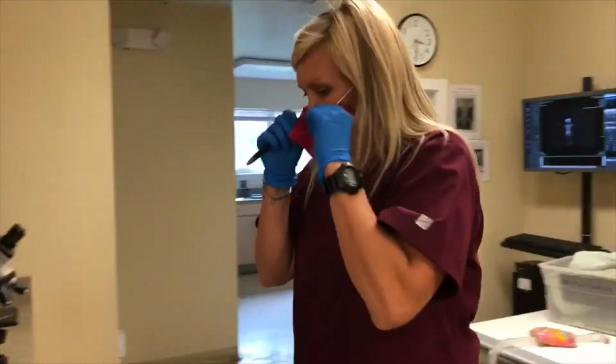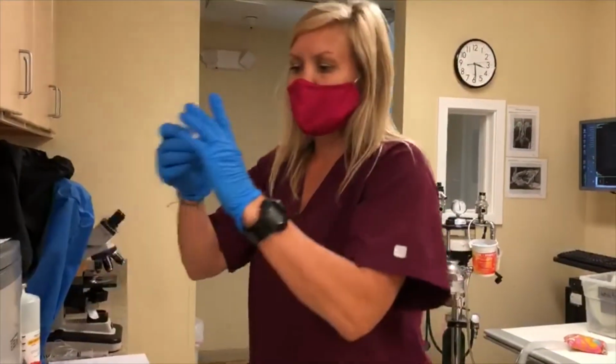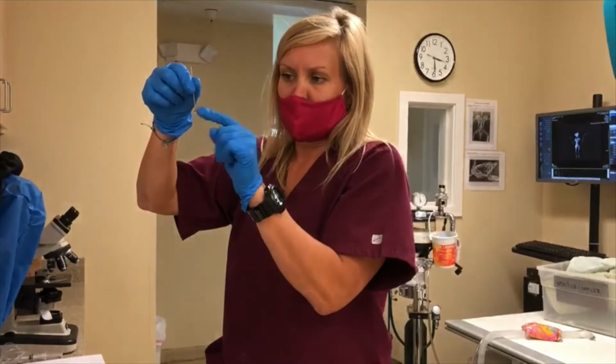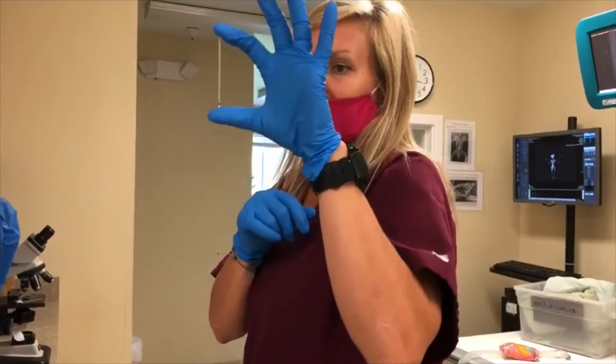If the animal was dehydrated or anemic, you'd be able to tell right away by looking at the blood tube, depending on how much liquid portion or how much of this red blood cell you see. So it can be an immediate reading by just glancing at it.